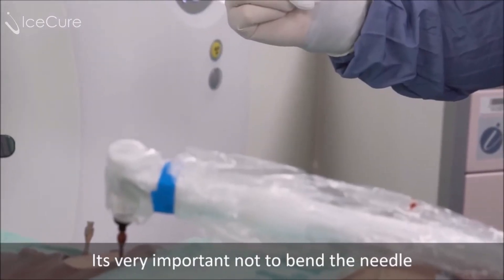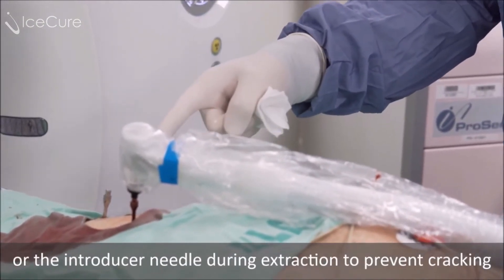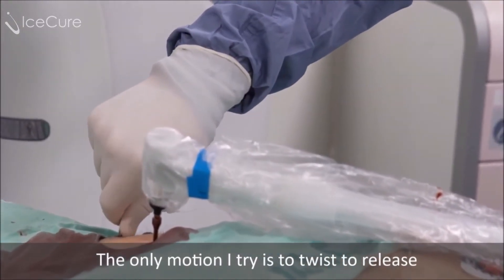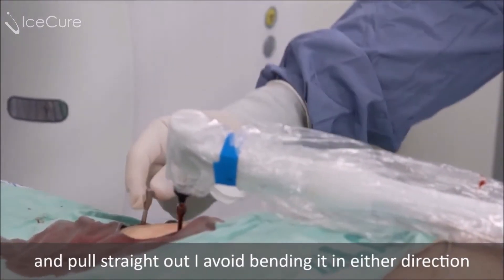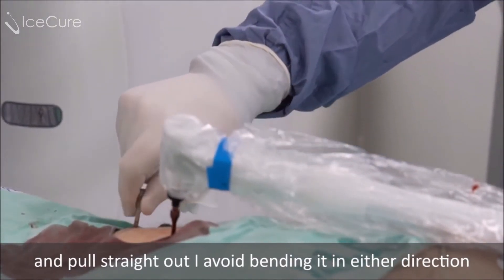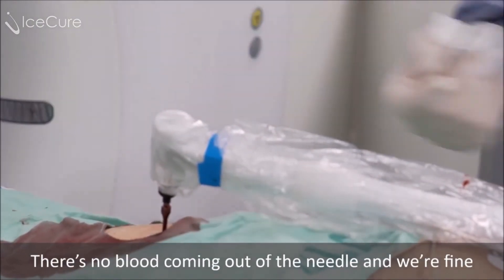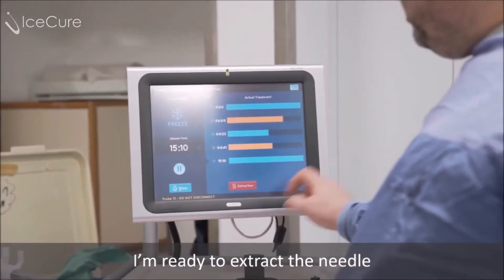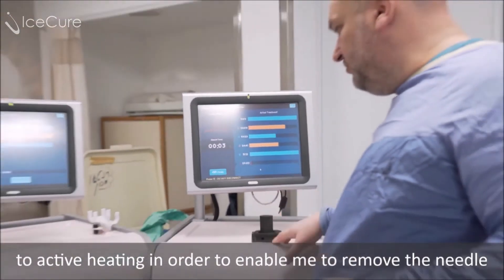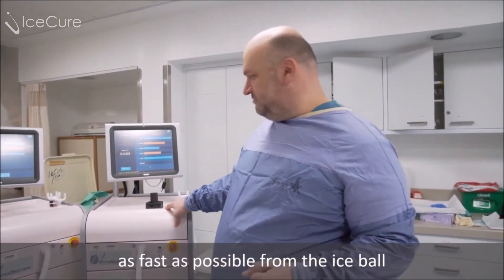It's very important not to bend the needle or the introducer needle during extraction to prevent cracking. The only motions I do is try to twist, which will release it, and pull straight out — I avoid bending it in either direction. There's no blood coming out of the needle and we're fine. I push the extraction button and the machine will switch to active heating in order to enable me to remove the needle as fast as possible from the ice ball.